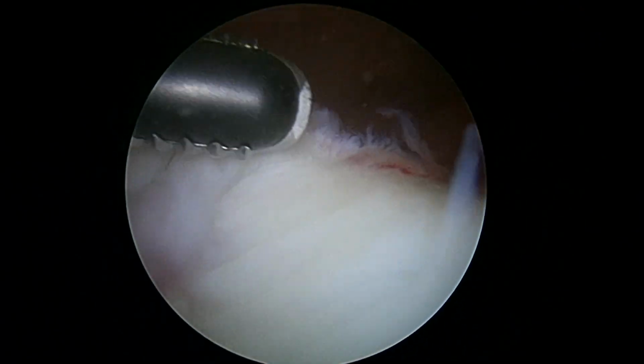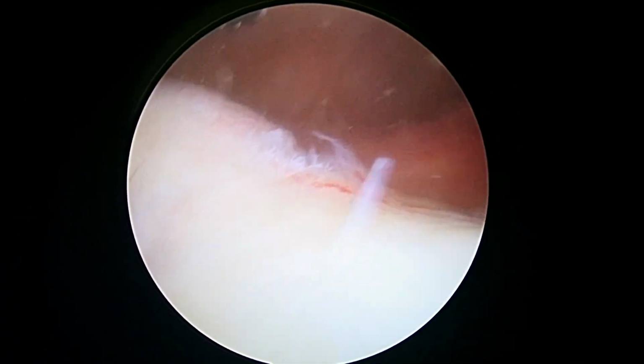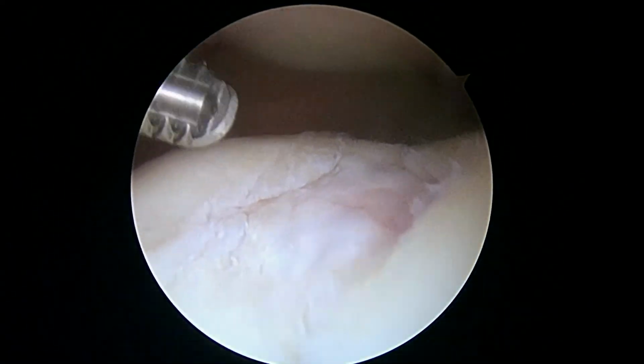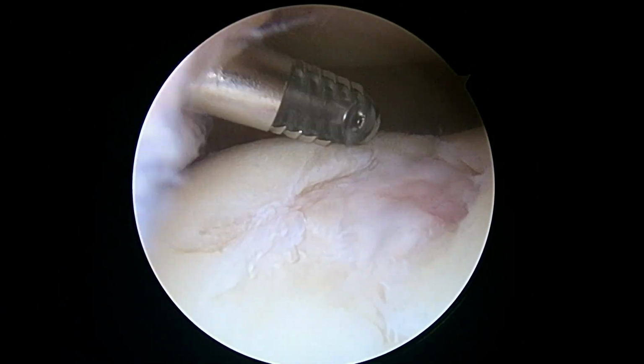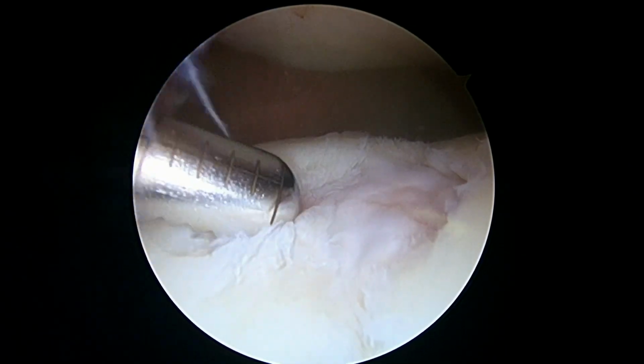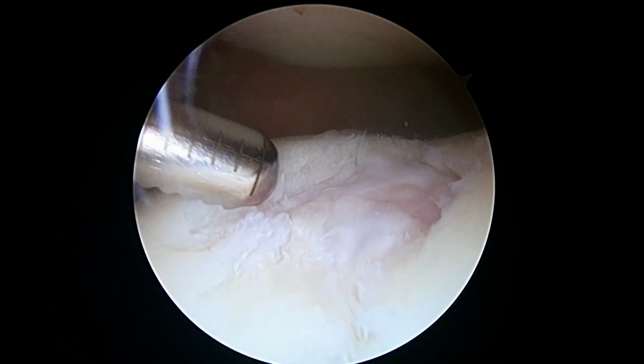So, again, more than I would like to see in someone as young as you are, but that's kind of the hand we've been dealt here. So we'll smooth it out as best we can. But this is no doubt where some of those loose chondral fragments are coming from as well.